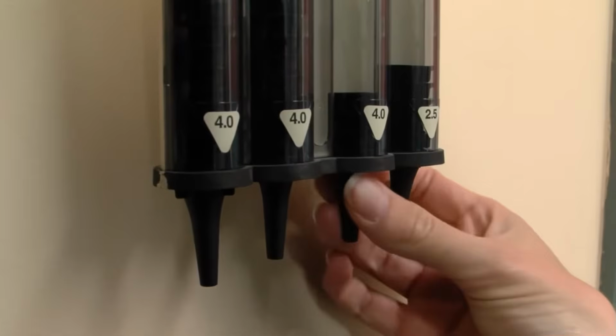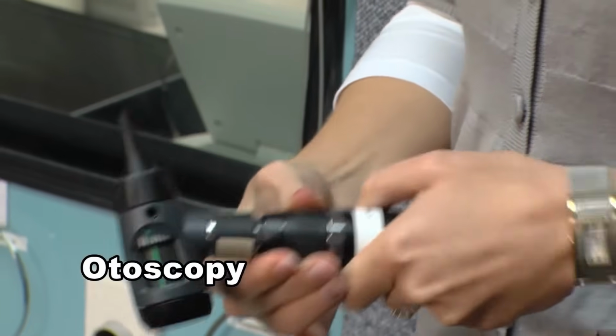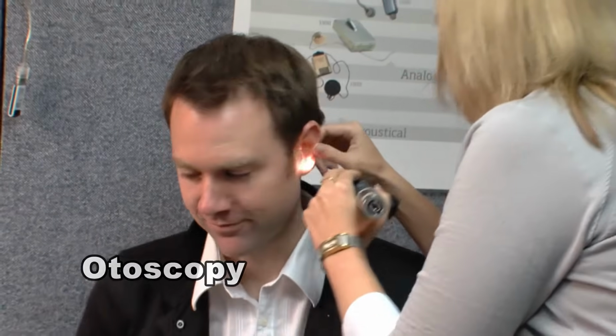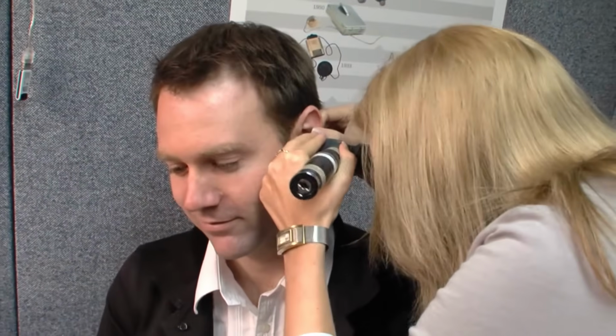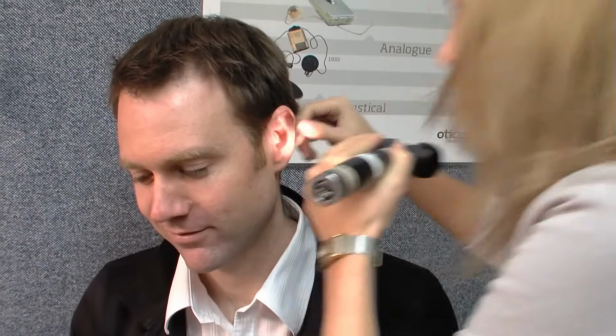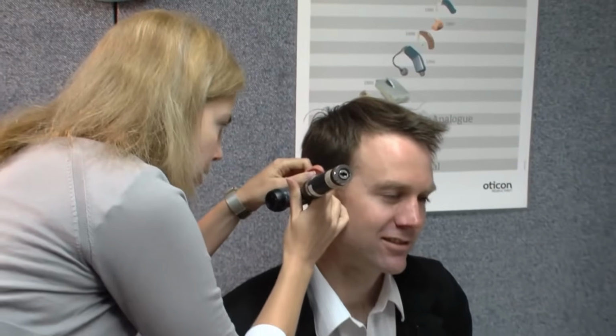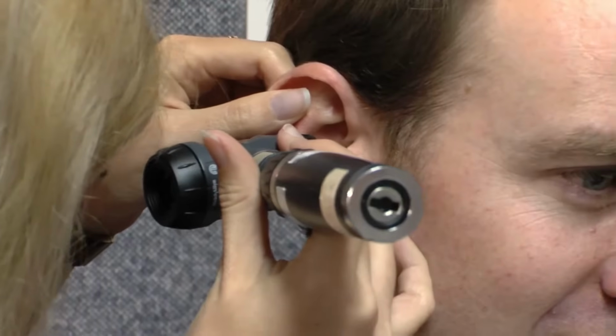Yeah, that's great. So what we'll do is I'll just have a look in your ears for a start and then we'll get on with the hearing test. Great. Important clues about some conditions that may affect hearing can be obtained through an otoscopic examination of the client's ear canals. Good. And we'll just check the other one. Otoscopy also establishes whether the patient's ear canals are sufficiently free of wax or other debris to proceed with testing.